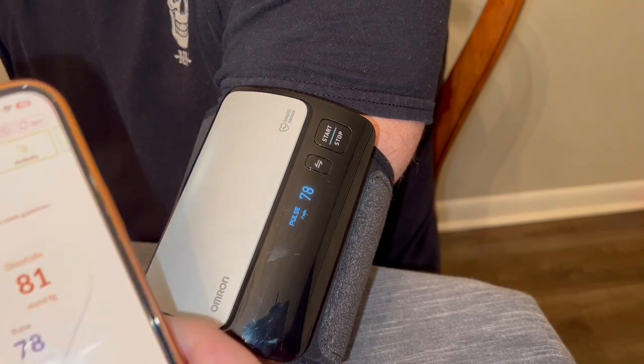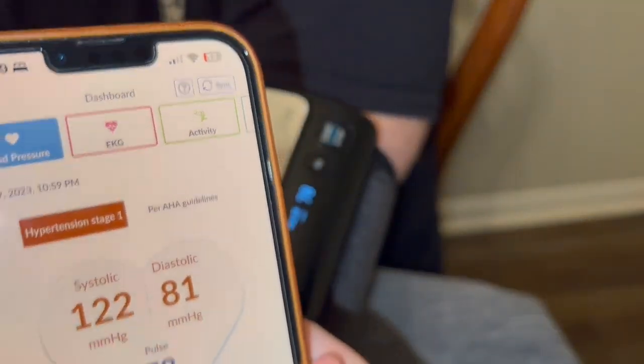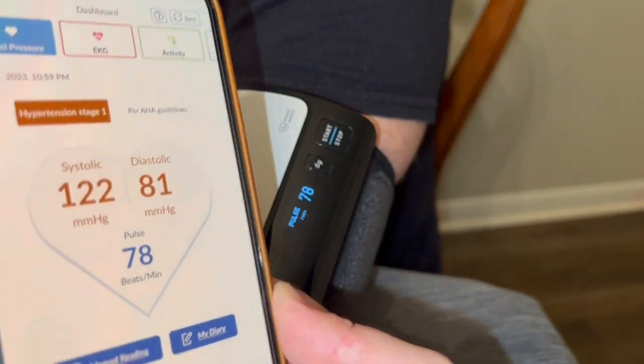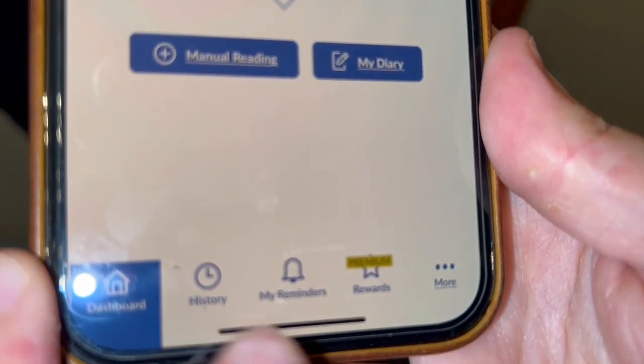As you can see here, you just go up to the corner and you press sync, and it will actually show the reading on here. And as you can see, it's the same thing. If you look down here, they've got different history reports that you can look at.